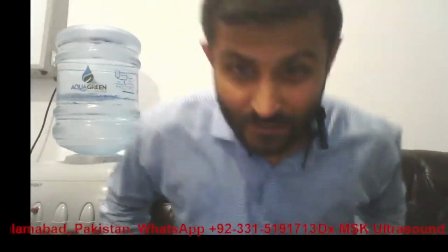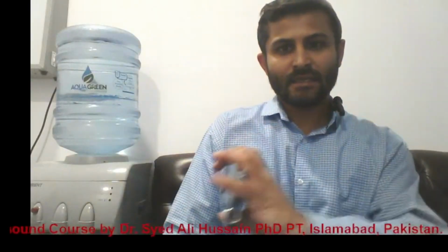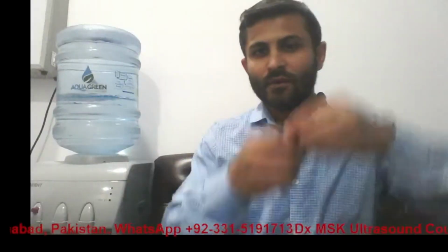What is meant by long axis? The bicep runs from here to here. The bicep runs from top to bottom like this. This is the longest possible dimension of the bicep. So if we place our transducer just like this, it's going to be long axis. If we place our transducer like this, it will be called short axis. It is similar to as if you want to cut my bicep. If you want to make long strands, it will be called long axis. If you want to have small slices, it will be called short axis.